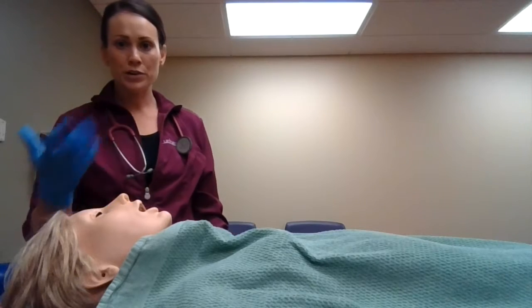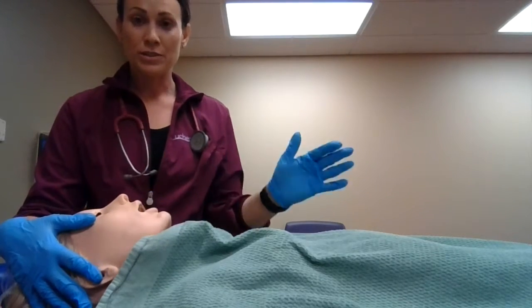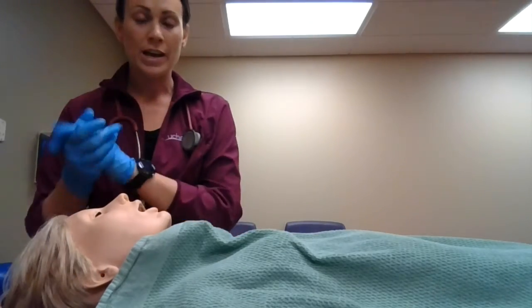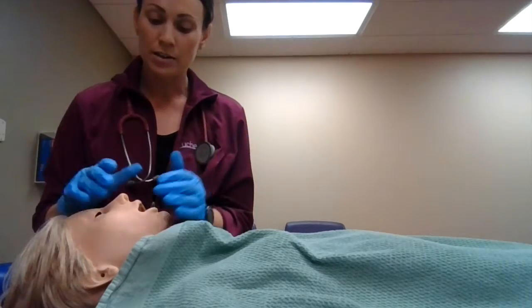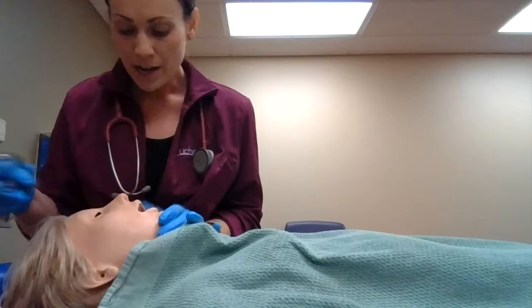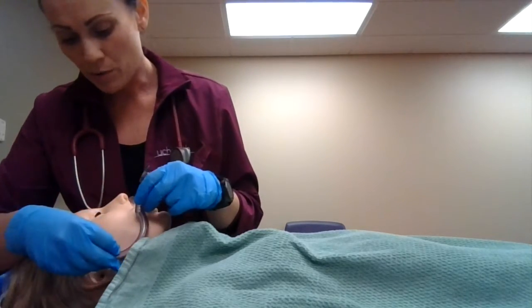Come into the room. Kate with respiratory, introduce myself. Patient is not responsive, but I introduce myself now to the staff in there, and to the patient. I went ahead and just washed my hands, put on some gloves, and I have my oral pharyngeal airways in my hand. I'll go ahead and look at Mrs. Smith and just measure real quick what kind I want to use.